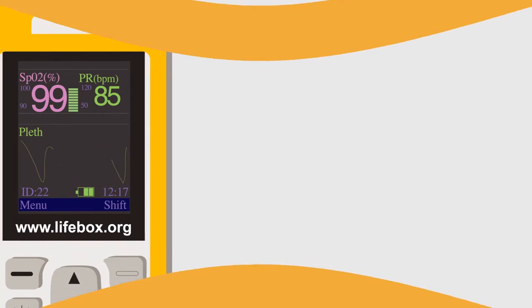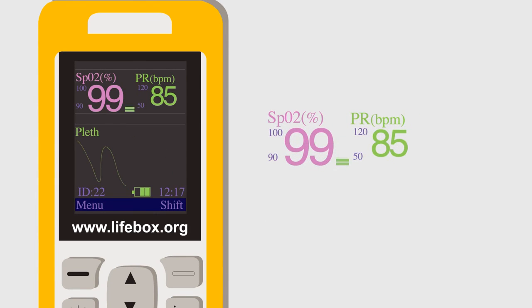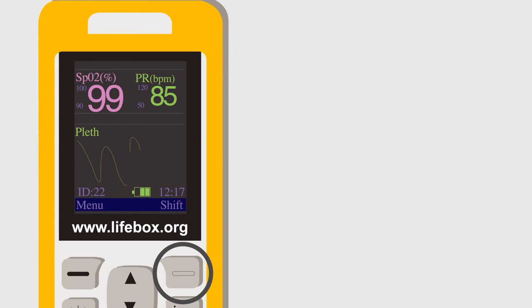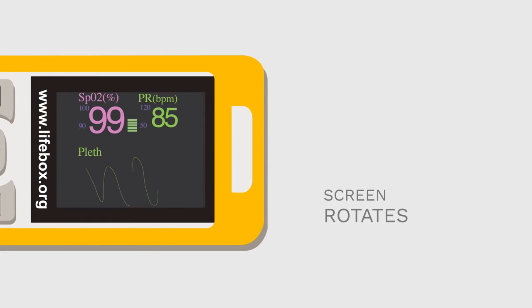There are no buttons on the display. That's important to keep in mind because too much pressure on the screen can damage it. On the display, you'll see a reading of your SpO2 as well as your pulse rate or heart rate. Don't forget that pressing the top right button will make the waveform appear. You'll also see that the screen rotates. If you turn it 90 degrees, the display information will follow.